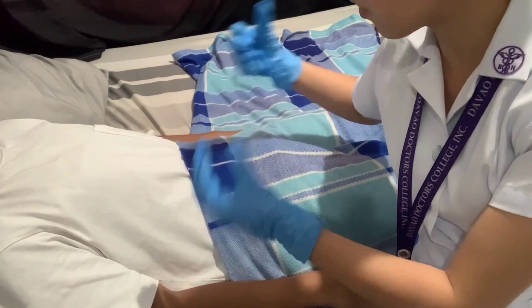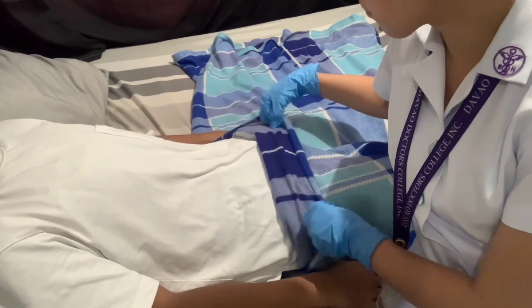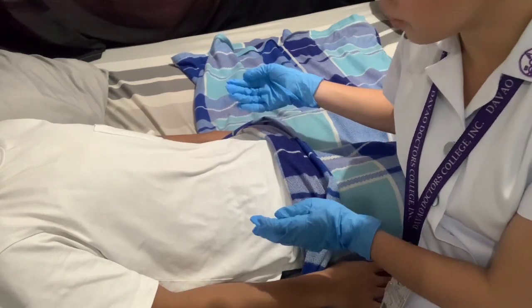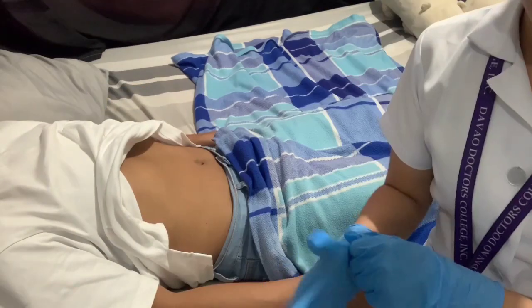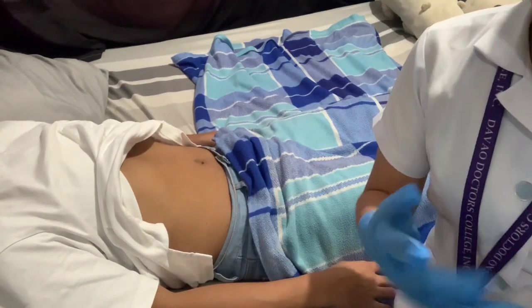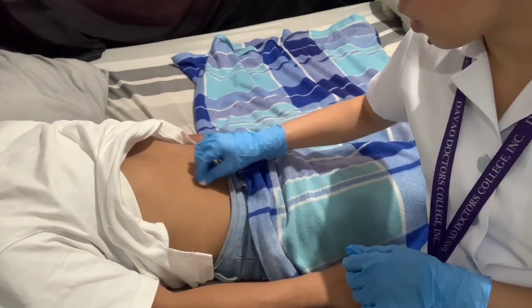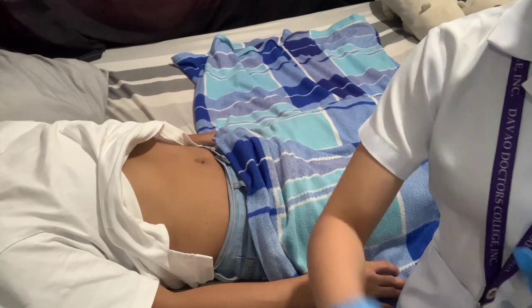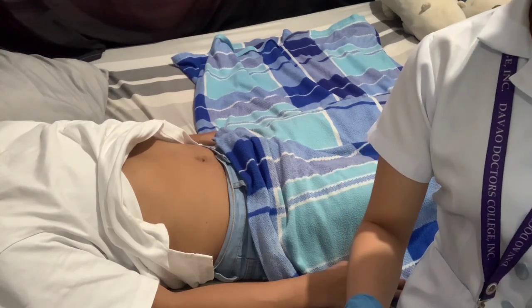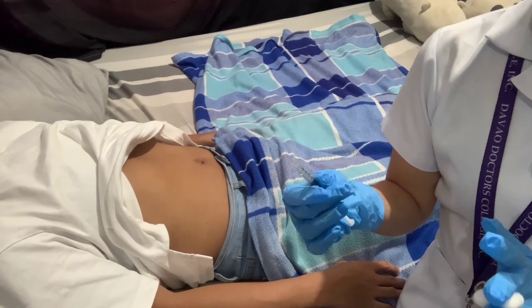So okay sir, I'm now going to inject you into a subcutaneous route. So let me just expose your abdomen. Will that be okay with you? Yes. Okay, thank you. So now I'm going to clean the area in a circular motion, inward to outward. So now I'm going to uncap the syringe, and then I'm going to inject now the medication.